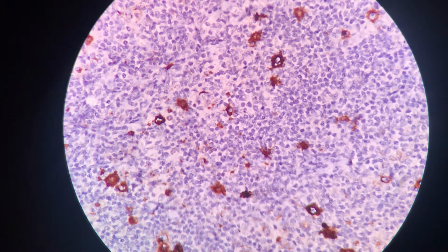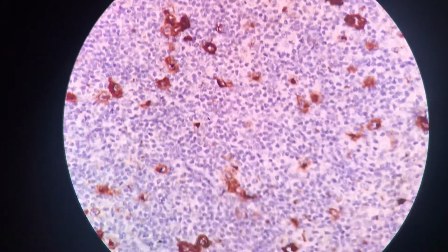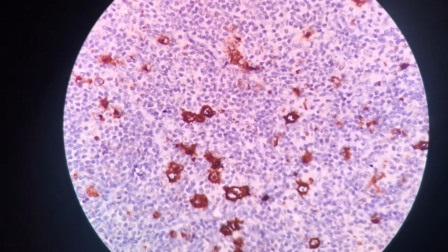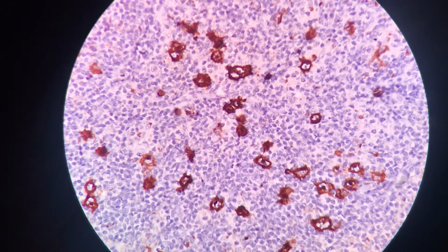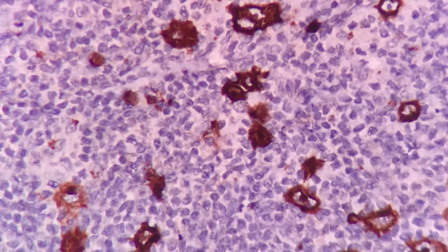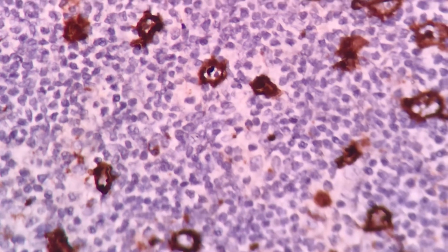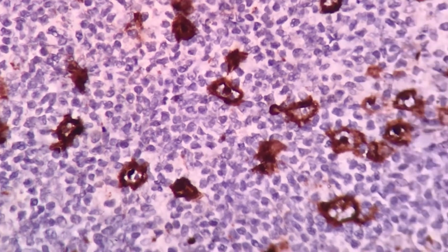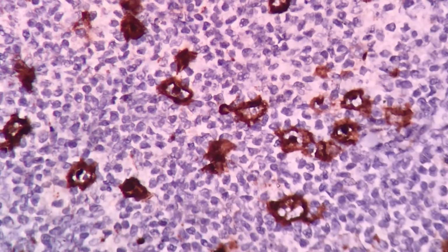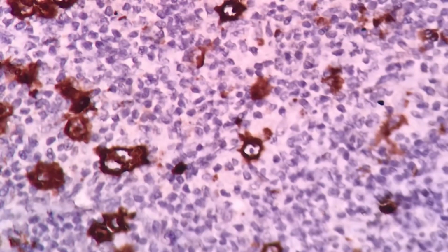You could actually make out that these cells have taken up intense cytoplasmic staining with accentuation in the Golgi region. This staining of the Golgi region is appreciable as a dot in the paranuclear location.